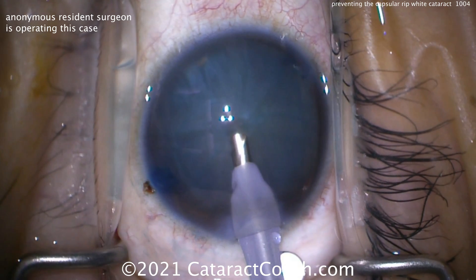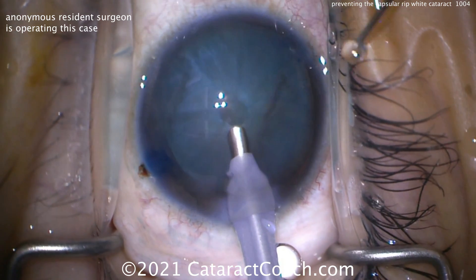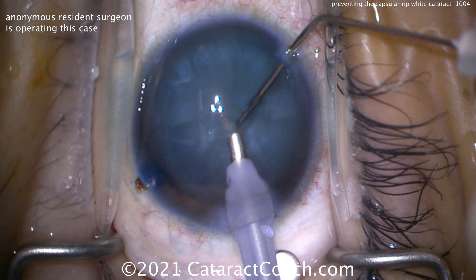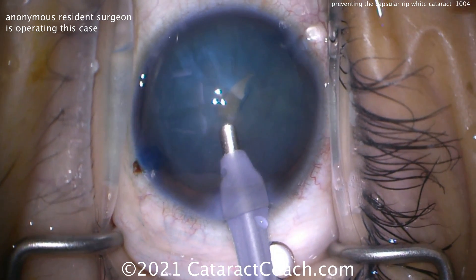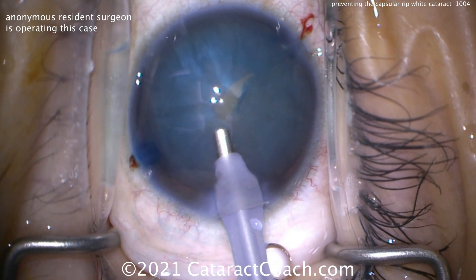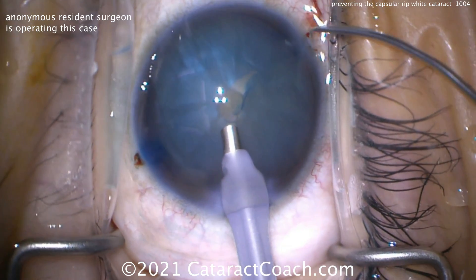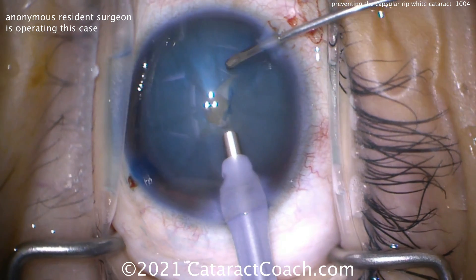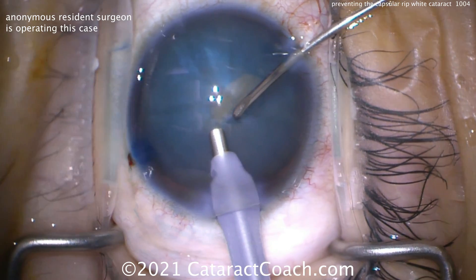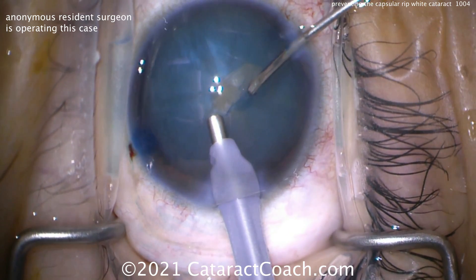Ideally, you want this phaco probe to be almost aiming towards the optic nerve in the eye — aiming straight down so that you get a nice round hole in the lens capsule. A little more viscoelastic being put in there, and we're going to buzz in with a probe. There's an opening, but it's already ripping out. Keep the phaco probe in the eye. That initial buzz was okay but didn't create a perfectly round opening because the resident didn't have the round tip fully touching the lens capsule. But we have the infusion pressure set very high — a very high bottle height, infusion pressure of 95 millimeters of mercury. That's going to help, so we'll keep that phaco probe in the eye with one hand.